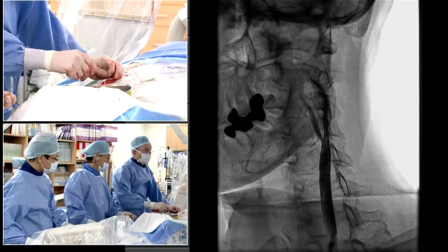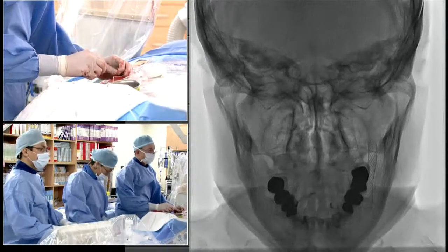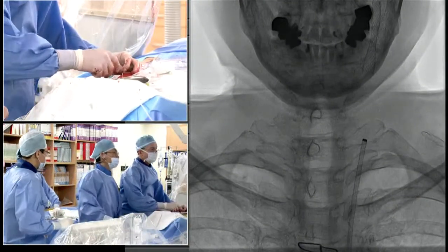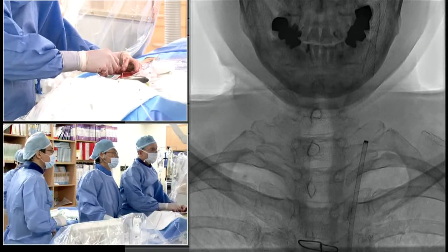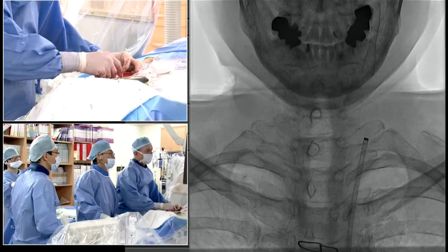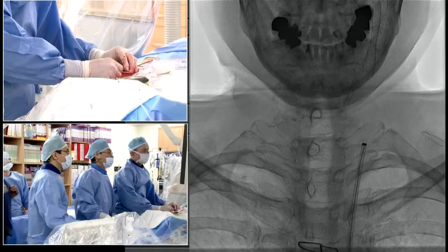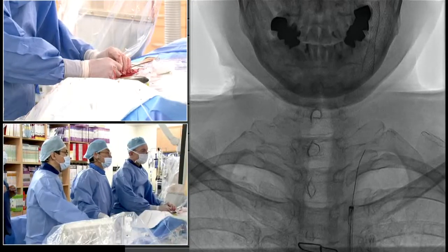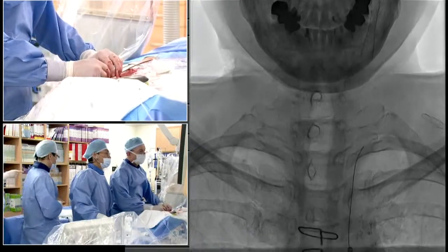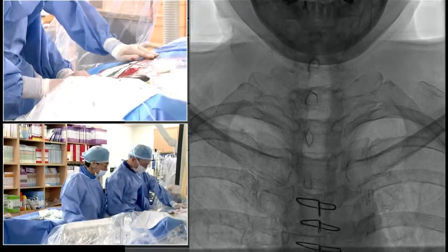So, one other thing, which I think is kind of a small point, but it might be worth discussing: when removing the sheath, I'm always reluctant to just pull that back out of the carotid, because as the tip kind of whips out of the common carotid, I'm always afraid that I'm going to scrape the common carotid artery. Do you think I'm being paranoid with that, or is that something that others do? I routinely do that. I think it's a great idea to do that, especially over here you've got a type 2 plus arch, as you had said, and more of an angulation as you pull that out.